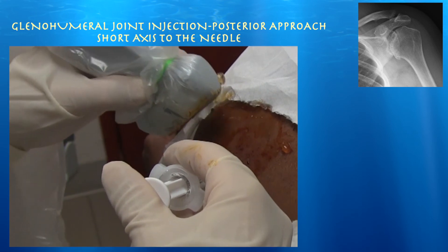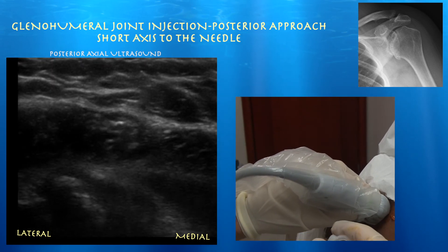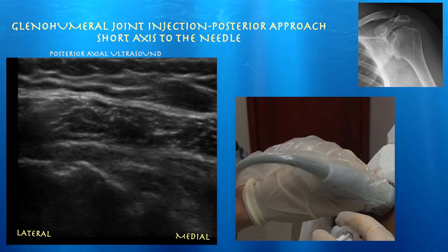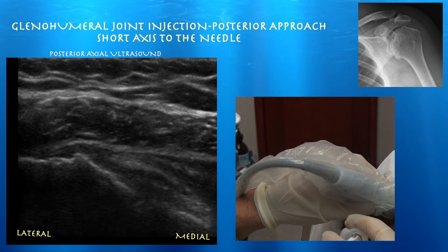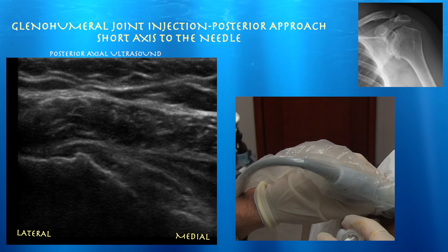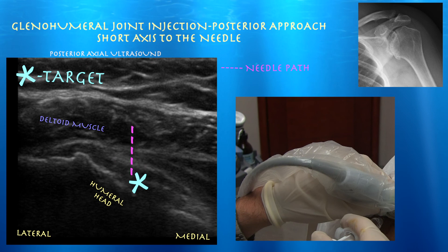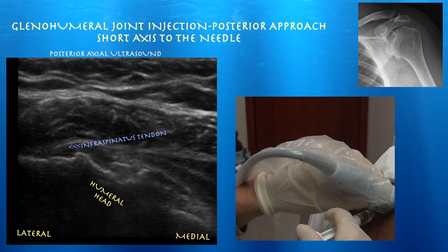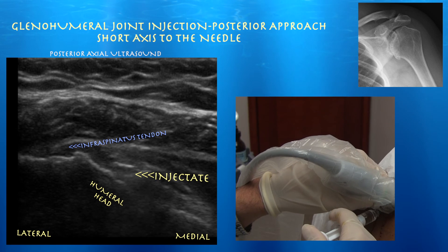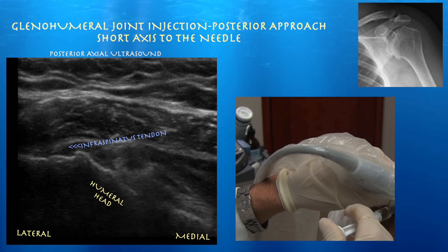You can see some movement there — that's the needle. You don't see the needle itself, but you see the tissue move. Here we're just looking at the tip of the needle and you can see some movement of tissue. Here's the path that we took with our needle going down into the joint — right in the joint. You can see the injectate right next to the humeral head, confirming that it's within the glenohumeral joint.